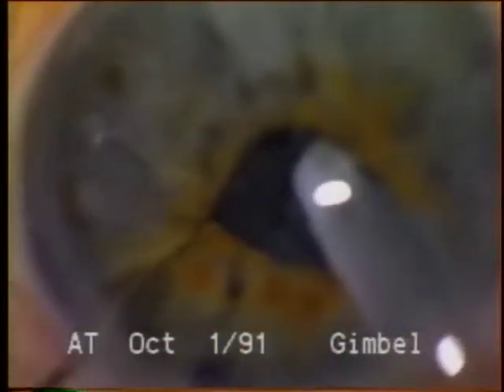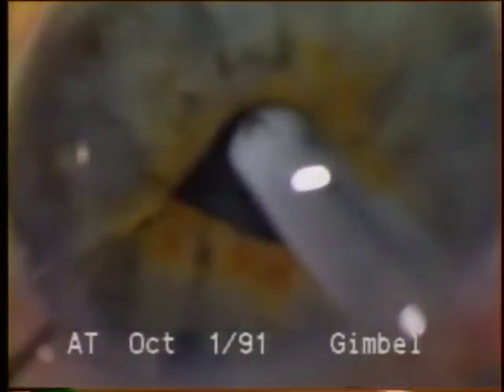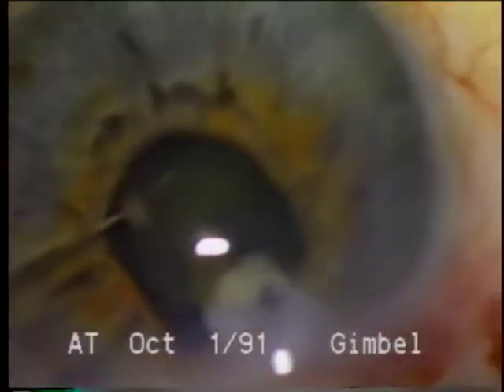We would not attempt phacoemulsification in this small pupil in the presence of a brunescent lens, but in a lens that is judged to fracture easily, it can be attempted once experience is obtained in these techniques. So a lot of the phaco, at least the fracturing, is done down deep under the iris.